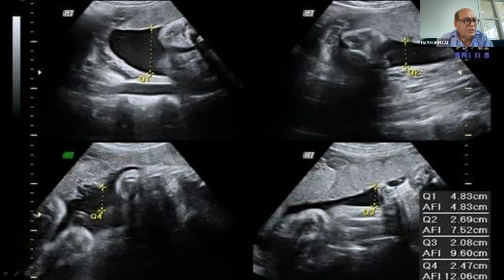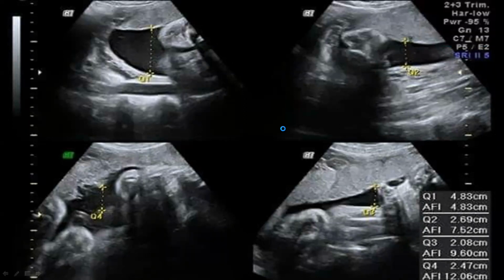Number 9, what is the first biometric measurement we take in second and third trimester USG? We already said that BPD is the first one. So A is the correct answer. And still some, 2-3%, think it's not the first one. Madam, the pre to post poll difference is from 77% to 92%. That's good. So that means there were quite a few who didn't think BPD was the first measurement. Good. Next, the last question.